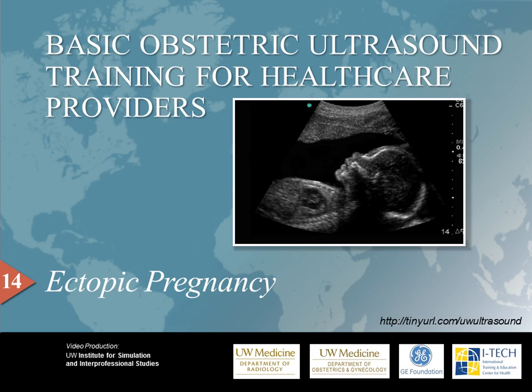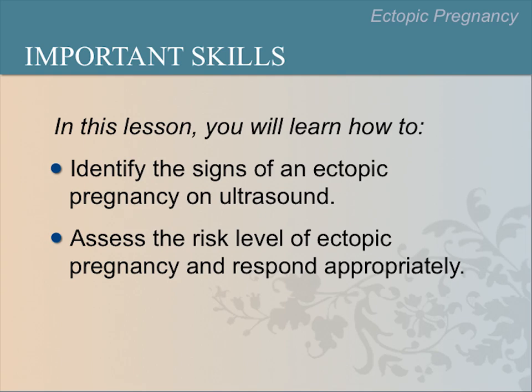My name is Dr. Christina Adams-Waldorf, and I will be narrating this 14th video in our Pregnancy Ultrasound series. This video will focus on ectopic pregnancy. Please visit our website for access to all of our video and training materials. In this lesson, you will learn how to identify the signs of an ectopic pregnancy on ultrasound and assess the risk level of ectopic pregnancy to respond appropriately.